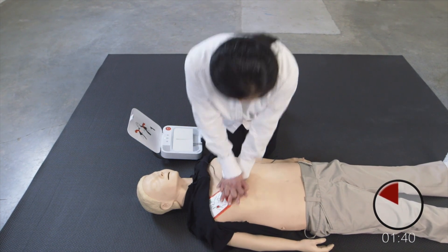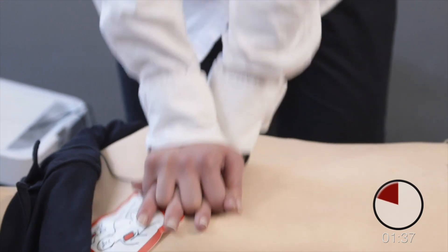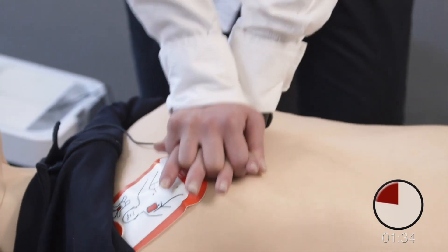Lean over the patient. Keep elbows straight. Use body weight to push.